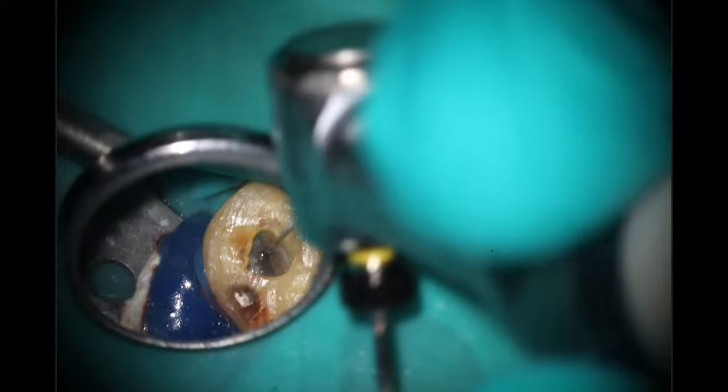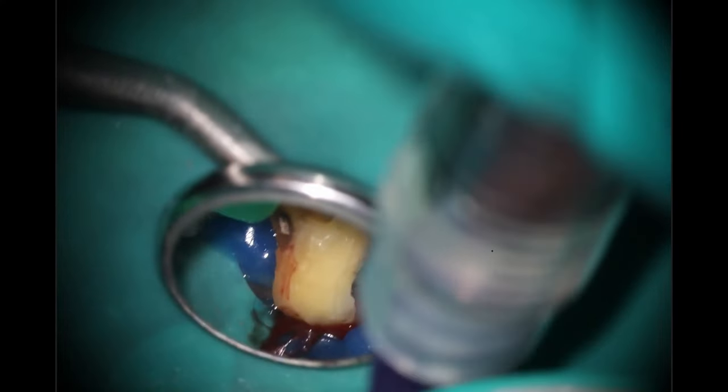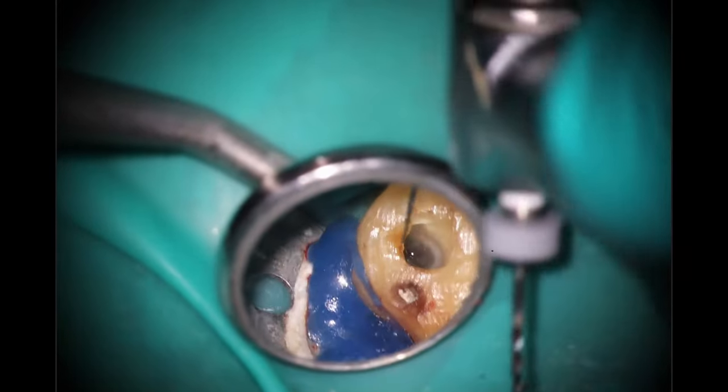A couple of things I like to do when you find a calcified case or any issues like that — I like to go in with that 2006 to open up the more coronal aspects. If there's any impediments, anything that might be in the way, that will get rid of them. For this case too, I'm going to be doing the squirt technique for the obturation on the two buccal canals. I ended up using a cone on the palatal, just because I don't think I'm going to be able to get a good seal in that area.